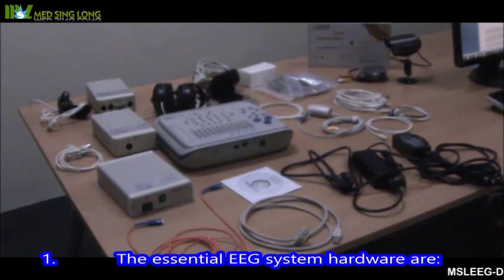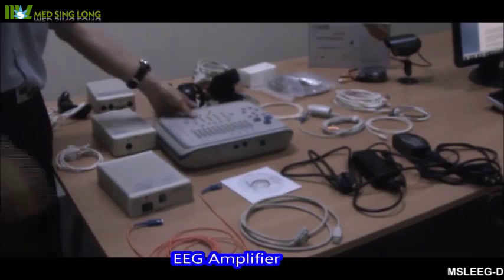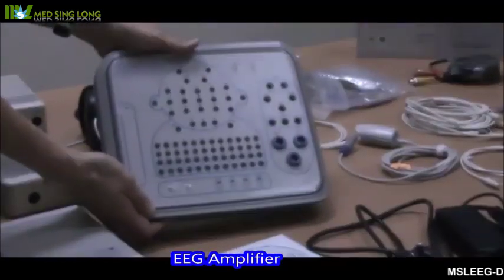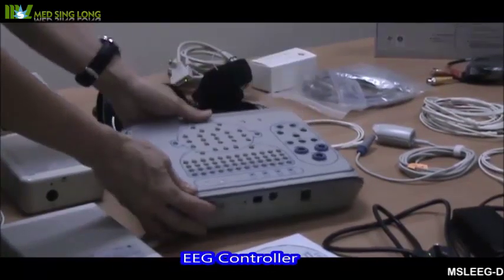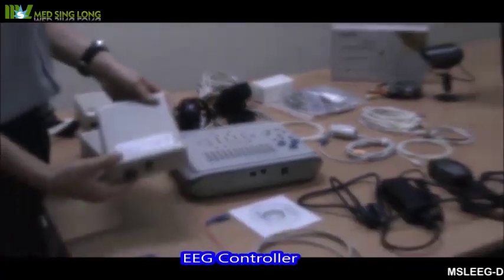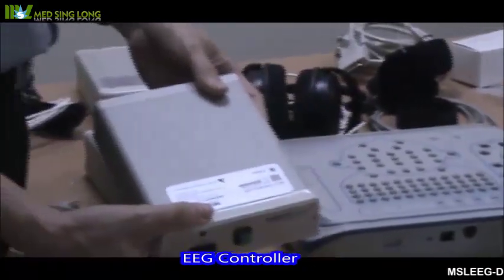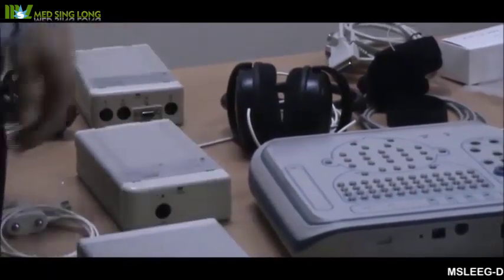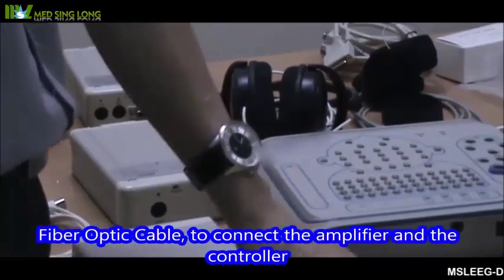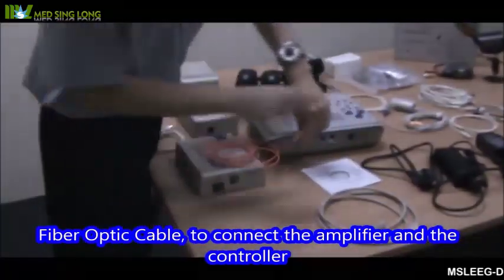1. The essential EEG system hardware are: EEG amplifier, EEG controller, fiber optic cable, to connect the amplifier and the controller.